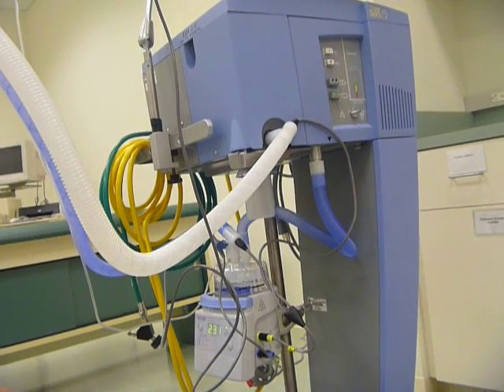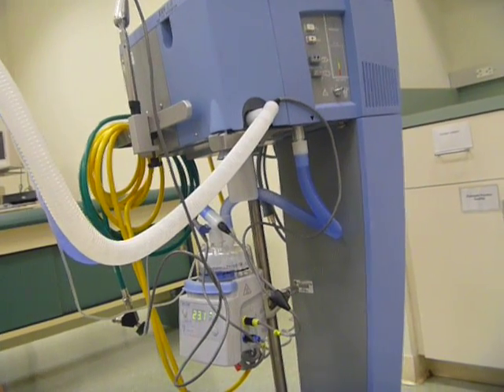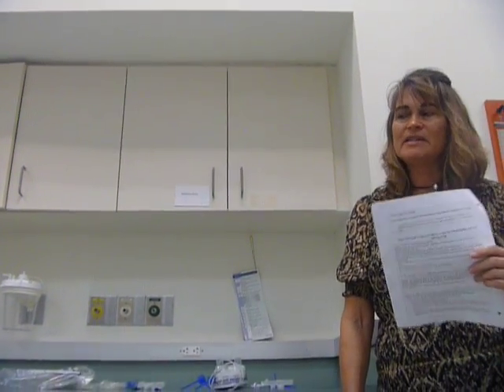Sometimes if the ventilator is on the patient, they have an HME, and now you're going to switch from the HME to a heated humidifier. They're already there, so you go ahead and put it on. It just takes maybe 10 minutes until it reaches temperature.